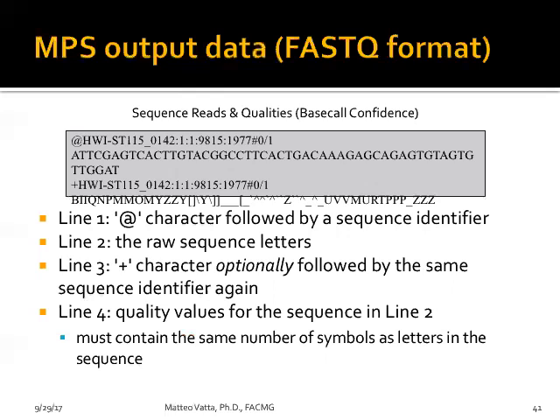Yeah, it depends on the technology you want to apply. Usually, real-time PCR has been, at least in the recent past, much faster than next-generation sequencing. But depending on the level of automation of the laboratory, next-generation sequencing can be done at a stat level, with short turnaround time. Just to give you an example, there are academic institutions like Kansas City or others that can provide whole genome sequencing with a 3 day turnaround time.